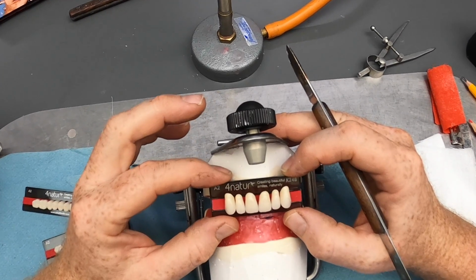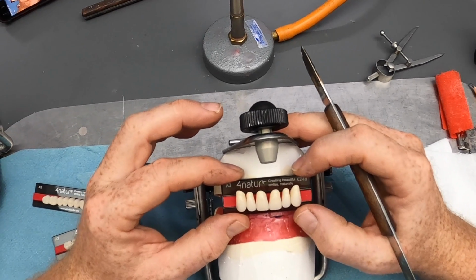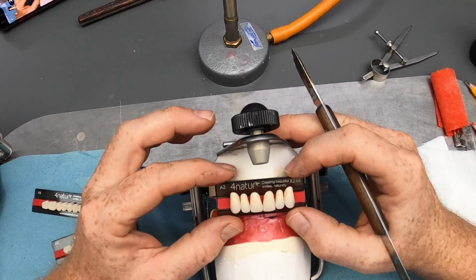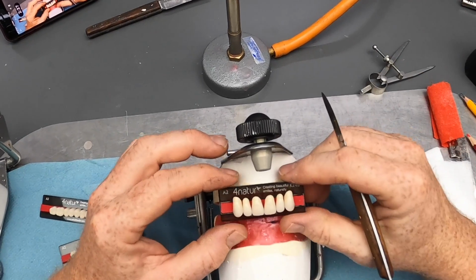Teeth come in different shapes and sizes. We've talked about that in a previous video, in the clinical videos, how to select those. This is the mould and shade that's been chosen for this particular case. So we can crack on and start setting some teeth.